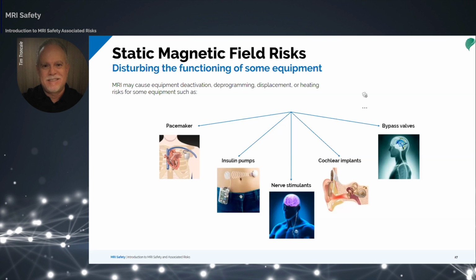It is also not enough that the patient has had one of these devices removed. It is essential to ensure that all components of the device were removed, including the wires. This is because it is not always about the function, but also about the possibility of heating and also induced electrical voltages.